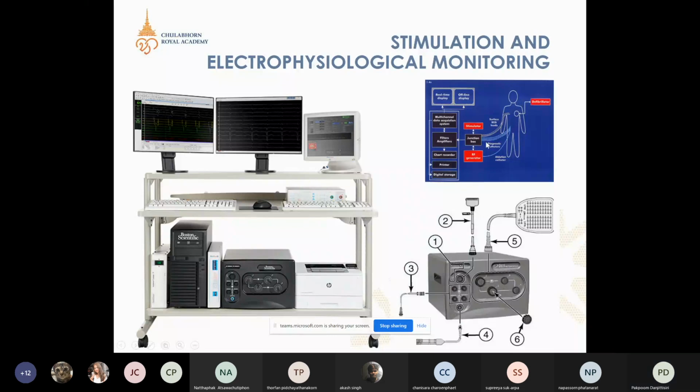And after all things are connected to the filters amplifiers, the function of the filters amplifiers is to filter all of the noise and the uninteresting signals that you don't want to see, and to amplify or increase the amplitude from the low amplitude that the catheter or the system receives from the body surface ECG or the intracardiac signal.